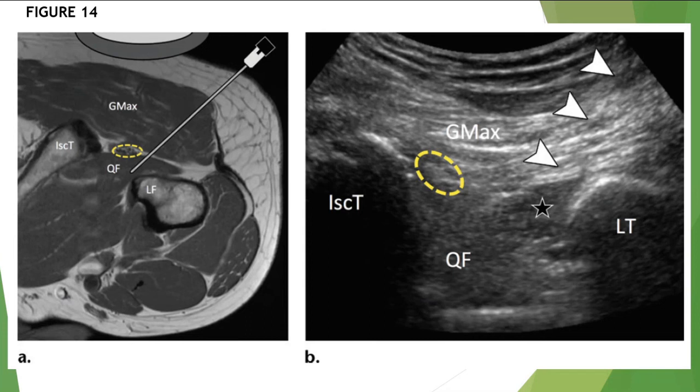This is similar. We can use the lesser femoral trochanter as an osseous landmark, and then we can advance keeping that as a reference, working our way towards the quadratus femoris muscle without approaching anywhere near the sciatic nerve. So I thought that was very illustrative.